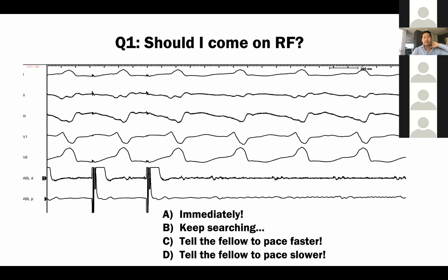Step one, is it a cut and paste job? Is it the same exact QRS? Well, I'm only showing you 5, so it's a trick question. But of the 5 that I have here, to me, it looks identical. So there's concealed fusion, assuming you're capturing. So it will always look identical if you don't capture, because it is the tachycardia.